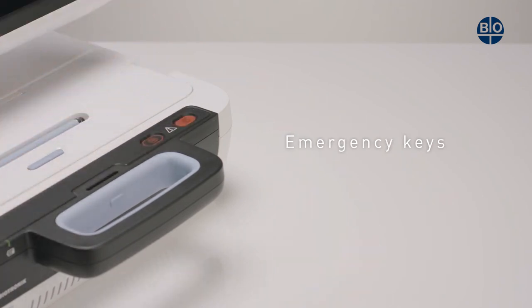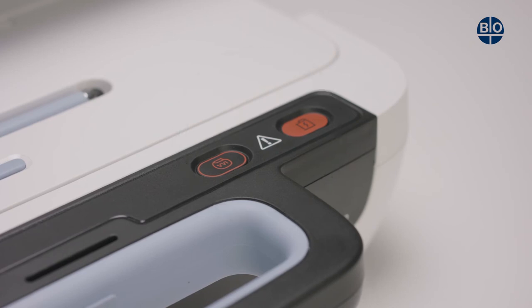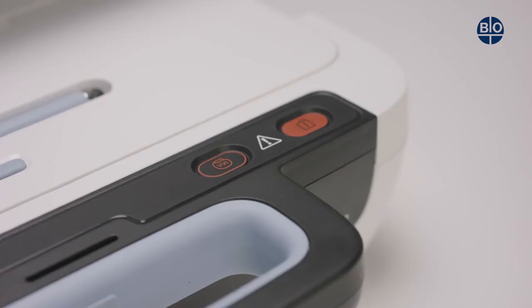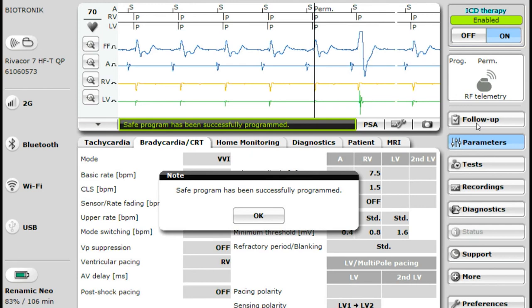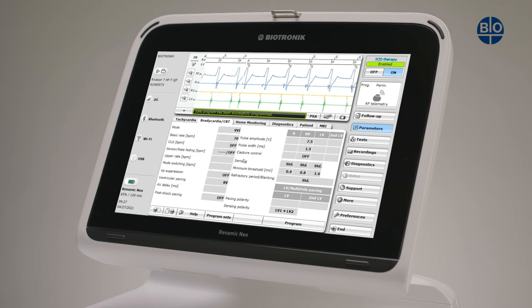The RENOMIC NEO has two emergency keys located here. Using one of the two emergency keys will start either the emergency pacing or the emergency shock. Pressing the SAFE program key will cause the following to occur: the current active programming in the implanted device, or the settings of the PSA, are replaced by the emergency parameter values and the SAFE program is started. The SAFE program remains active until a new permanent program is sent to the implanted device.